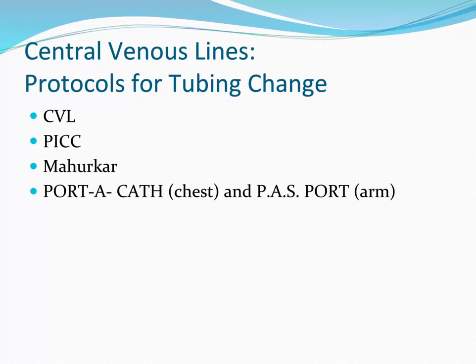TPN with lipids, even if an intermittent infusion is going through the TPN tubing: change every 24 hours. Chemotherapy or high dose infusion: change every 24 hours. Propofol tubing change should happen every 12 hours. If you encounter tubing not labeled for a change, it must be changed immediately.